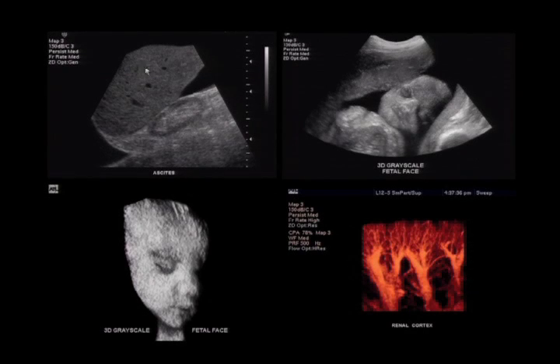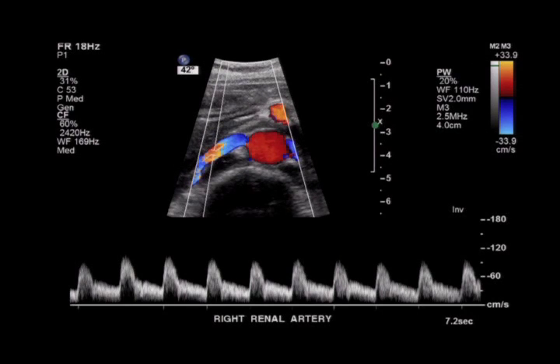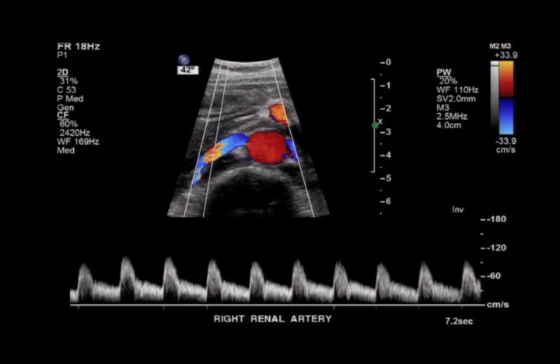Throughout the talk I'll give the basics of the imaging modalities being discussed. Ultrasound can give us images of various parts of the body—liver and kidney, free fluid, 3D images of a fetal face in pregnant patients, power Doppler images of renal arteries, and interrogation of blood supply showing direction of blood flow: red typically coming towards us, blue going away by convention. We can look at velocity of blood flow over time and get a lot of information about vasculature and tumors based on their vasculature.